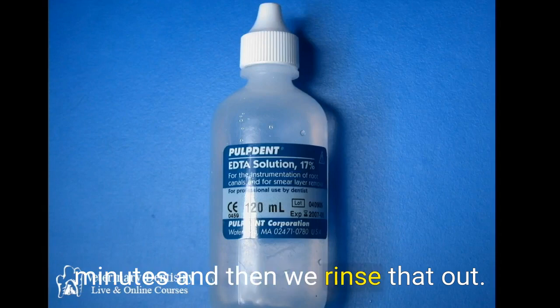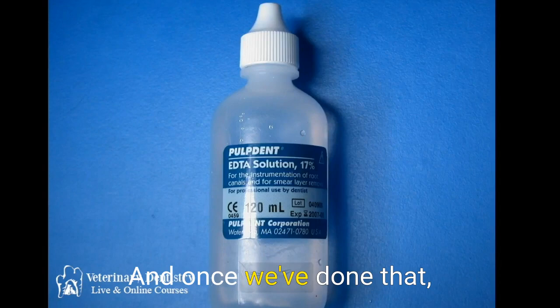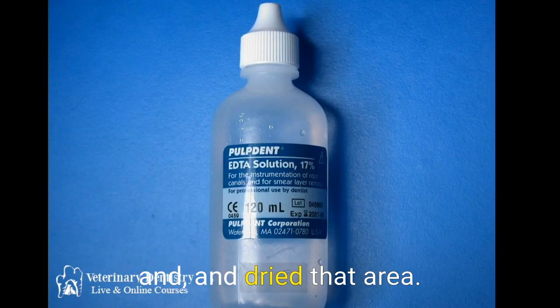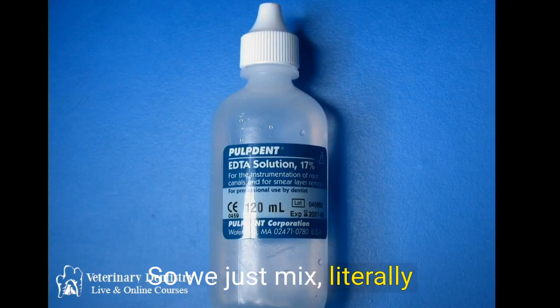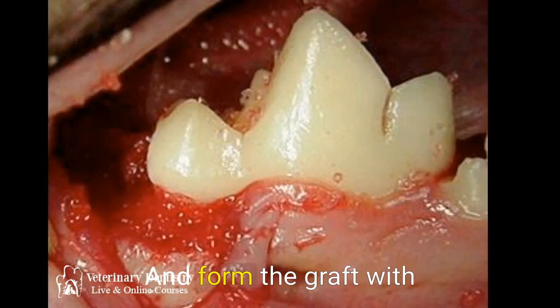Once we've done that, we flush and dry the area, then go in and put our bone graft in. With that process, we're going to have hemorrhage in that area, so we literally just mix our bone graft with the hemorrhage there and form the graft with the blood.